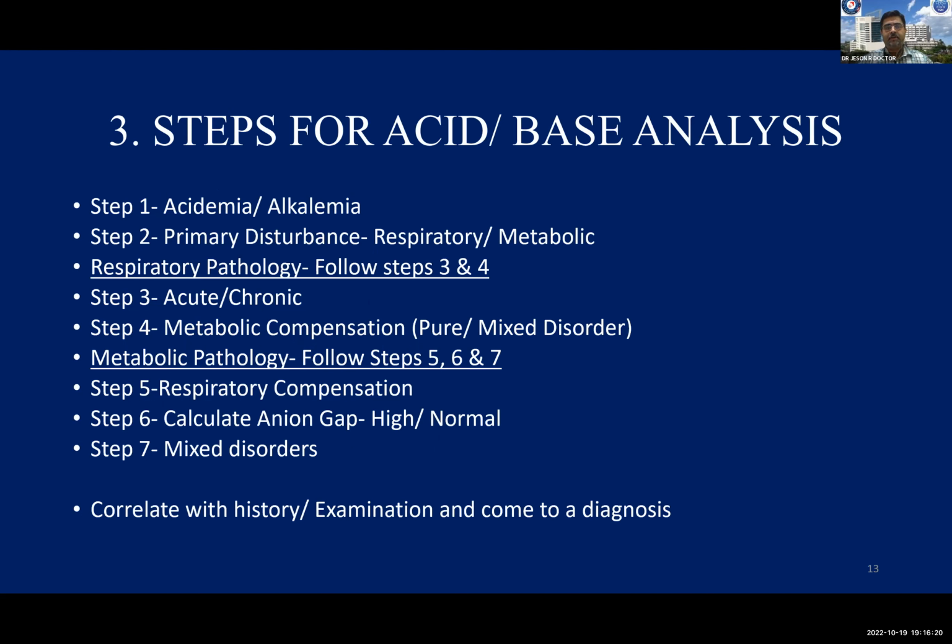Now, since my topic is perioperative point of care arterial blood gas analysis, I will not be covering the mixed disorders in very much detail because you seldom get these kinds of patients. More often than not, the patients who come up for surgery have pure or compensated metabolic or respiratory derangements and not mixed disorders, right? So that is a talk in itself, and I will not be covering that. So let me go through the steps for acid-base analysis.